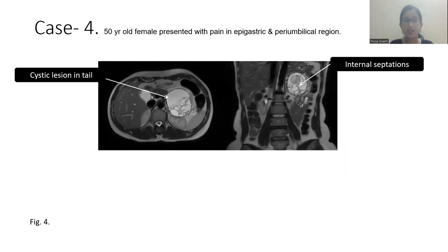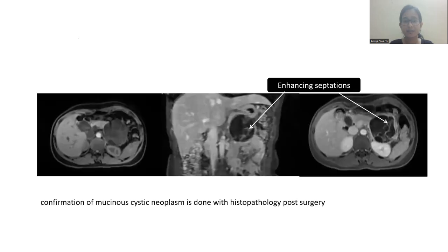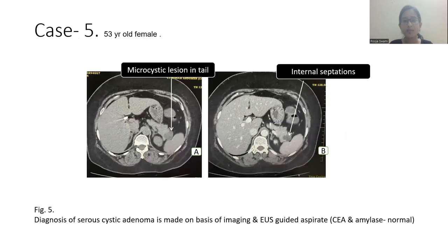Case 4: a 50-year-old female presented with pain in the epigastric and periumbilical region. Here we can see a cystic lesion in the tail with internal septation. Confirmation of mucinous cystic neoplasm was done with histopathology post-surgery.